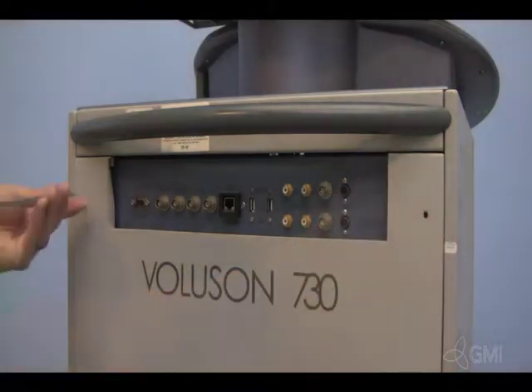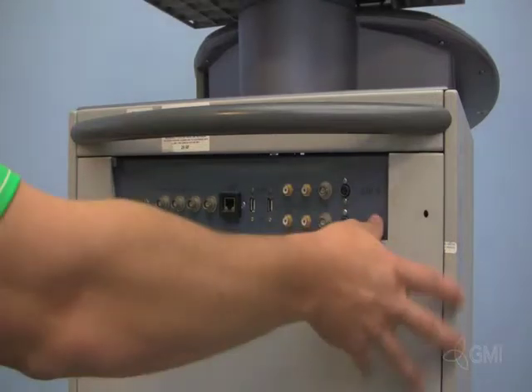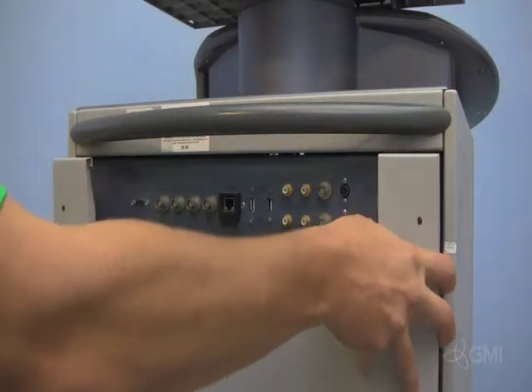Start with the system off and unplugged. Remove the two screws securing the rear panel. Remove the rear cover by leaning out from the top and lifting up.